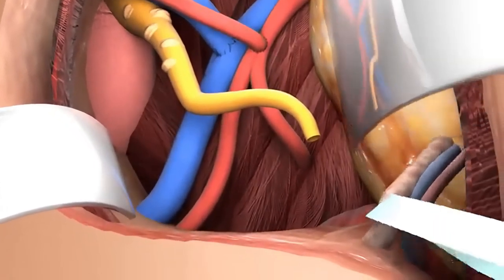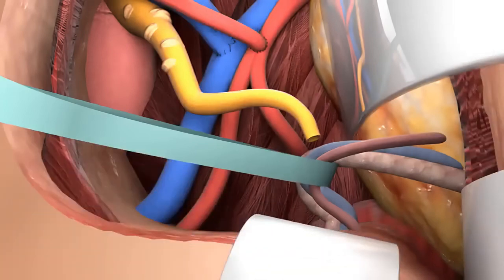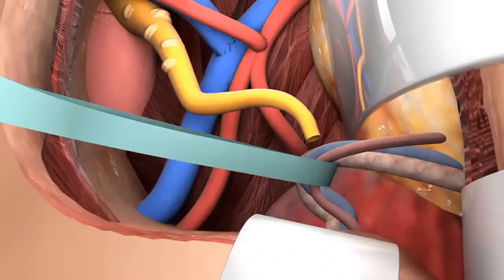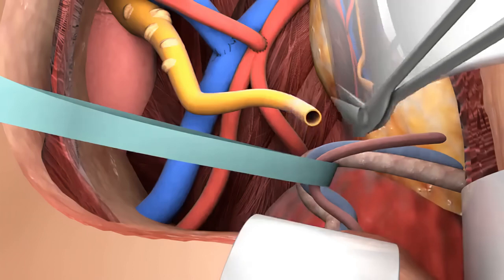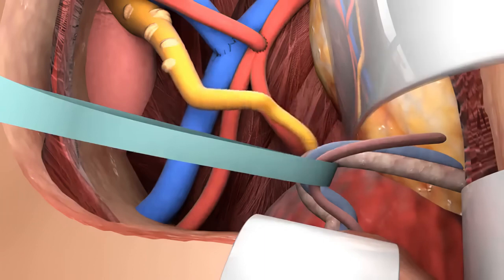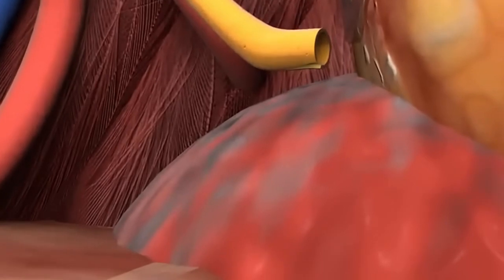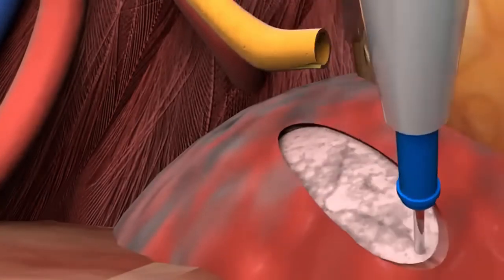When the perfusion of the kidney seems to be appropriate, the anastomosis between ureter and bladder is performed. Through the urinary catheter, the bladder is filled with saline. The ureter is cut to the right length and the lumen is spatulated by a longitudinal incision. It is dragged under the epigastric vessels and spermatic cord to the bladder. Production of urine may be observed at this stage.